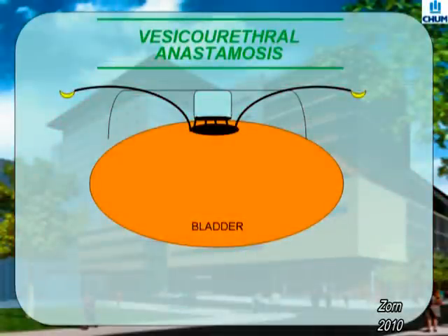The V-Lock Suture is then introduced to begin the reconstruction. With robotic precision, at least 12 to 15 sutures are placed around a tube no bigger than a pen to allow for watertight closure. This compares to 4 to 5 sutures during open conventional surgery.